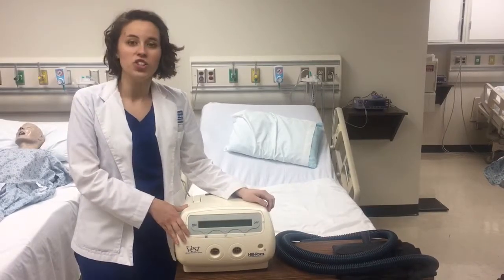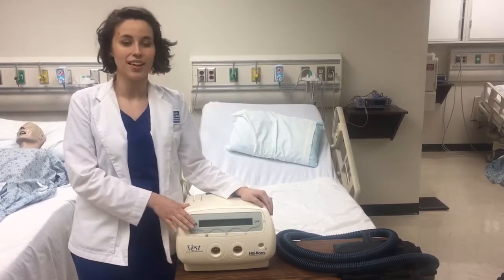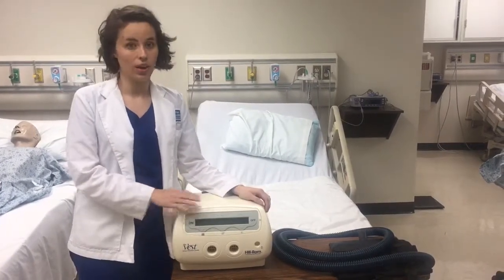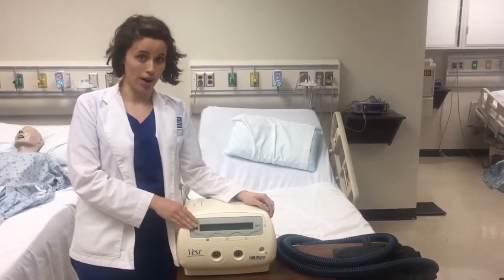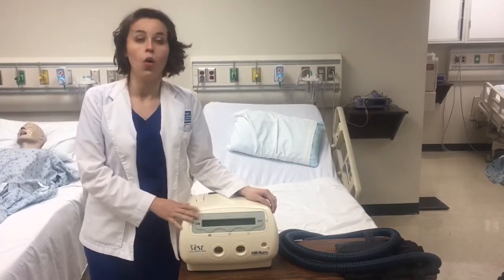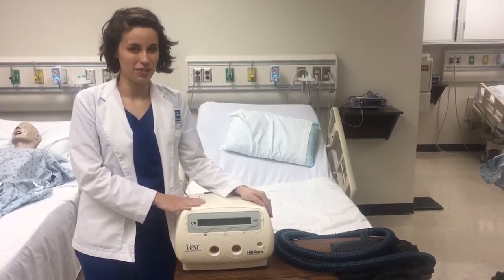contraindications. Once you have checked the chart for no contraindications, ask a caregiver, the nurse, or the patient when their last meal was. If the meal was less than an hour and a half prior, wait until it's been an hour and a half to prevent nausea or vomiting caused by the vibrations of the device.